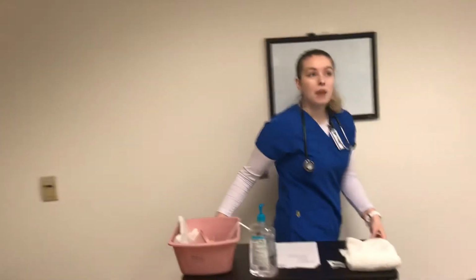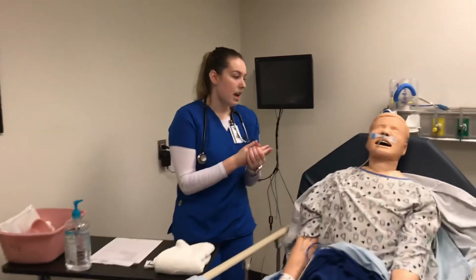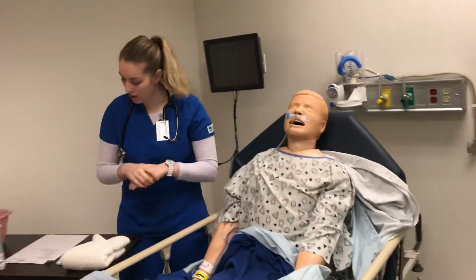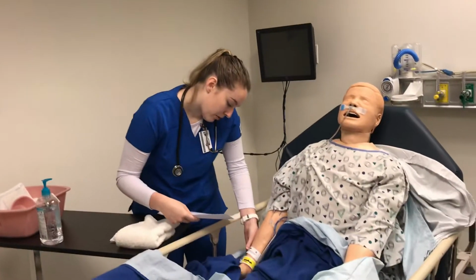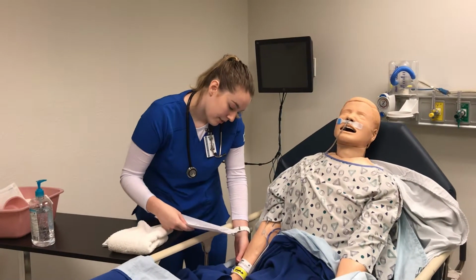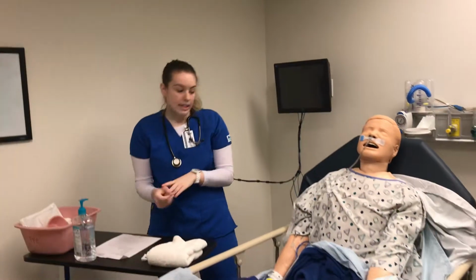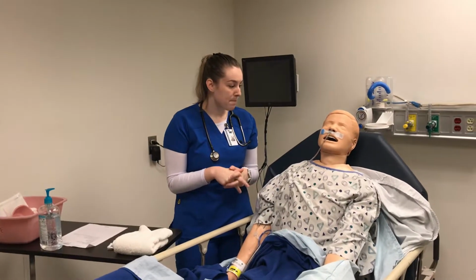So knock knock, and I would shut the door for privacy. Hi, how are you today? You're good? Oh, and how's your pain? It's better. That's good. So can I just get you to confirm your name and date of birth for me? Shirley Cost, 54, okay, and 5/14/64? 5/14/64, perfect. So I have the right patient. So Shirley, today I have an order to remove your NGT tube. You're feeling much better? Oh, good.